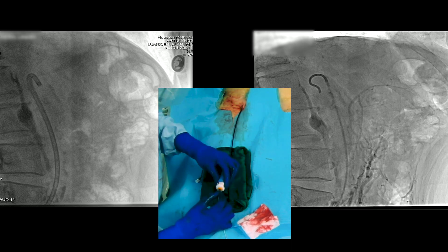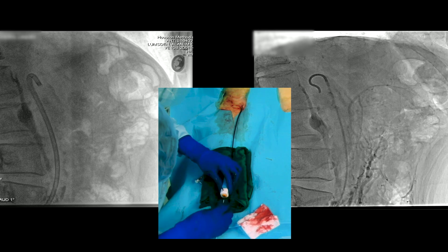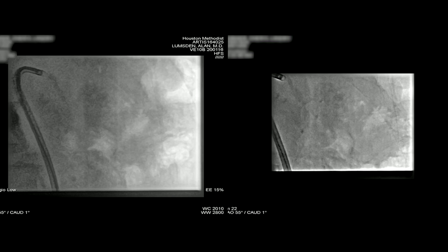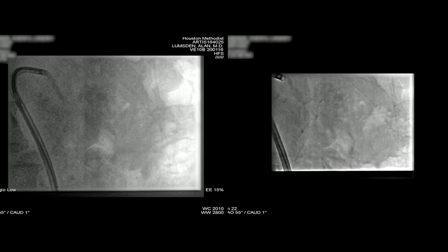Now I'm going to show you the value of Image Fusion. We made multiple attempts at free-handing this, and we've edited out a lot of this for content purposes — we never really could identify or engage the orifice. Here was probably our best shot. Through the Tour Guide is a Bernstein and a glide wire, and it just kept deflecting off the anterior wall of the aorta. So we had made multiple attempts in doing this.